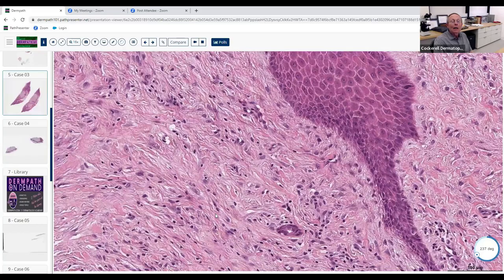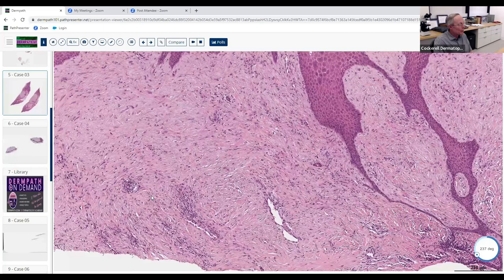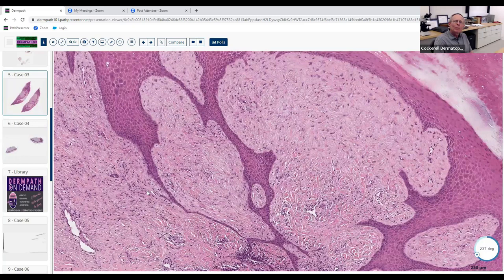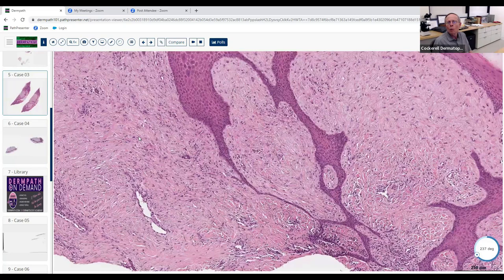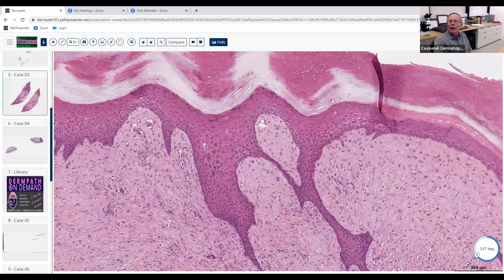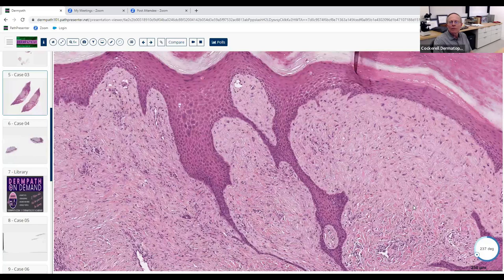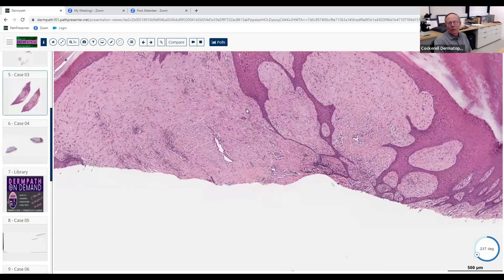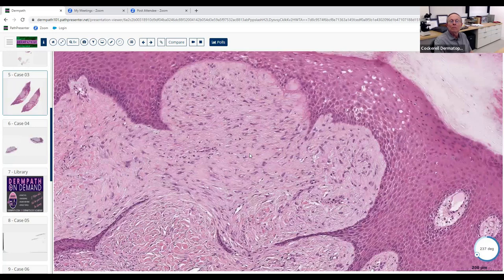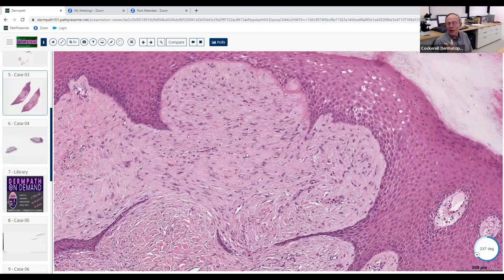That's consistent with a pleomorphic fibroma — occasionally you'll see some pleomorphic cells and it doesn't really mean anything. I think this is basically a periungual fibroma. You wouldn't need to distinguish precisely among those entities for the boards. However, if you saw more dilated blood vessels, is there a syndrome you'd be worried about with periungual fibrotic lesions? Yes — periungual fibromas are associated with tuberous sclerosis.